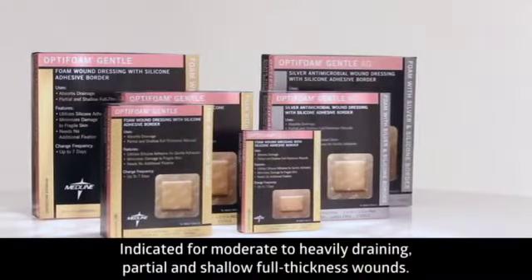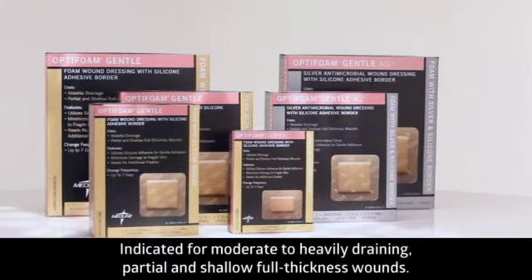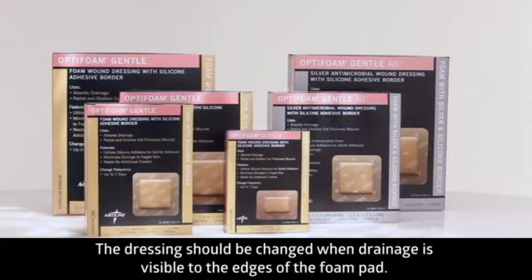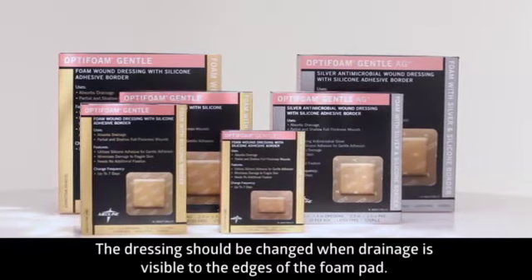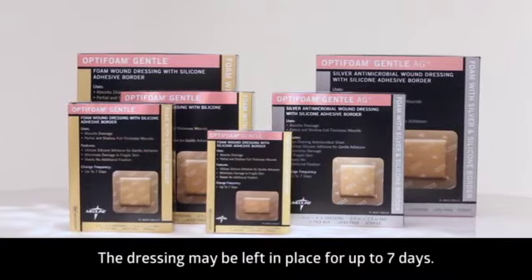Optifoam Gentle is indicated for moderate to heavily draining partial and shallow full thickness wounds. It should be changed when drainage is visible to the edges of the foam pad. The dressing may be left in place for up to seven days.